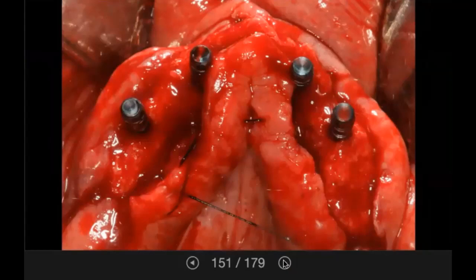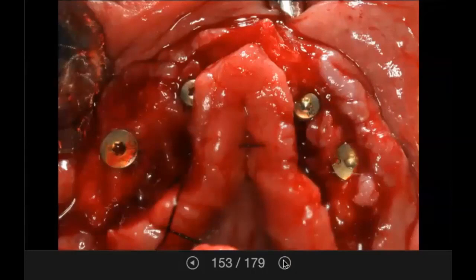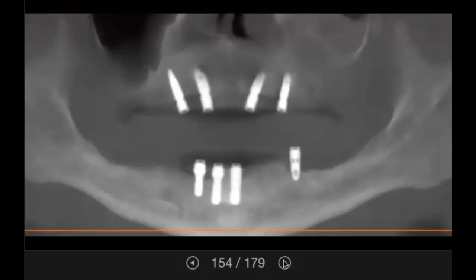Here we can see the implant transfer assemblies. All implants are 100% covered in bone and with minimal implant divergence. Stock healing abutments are in place. Here is a post-operative film after the use of the bone-supported surgical guide and implant placement.